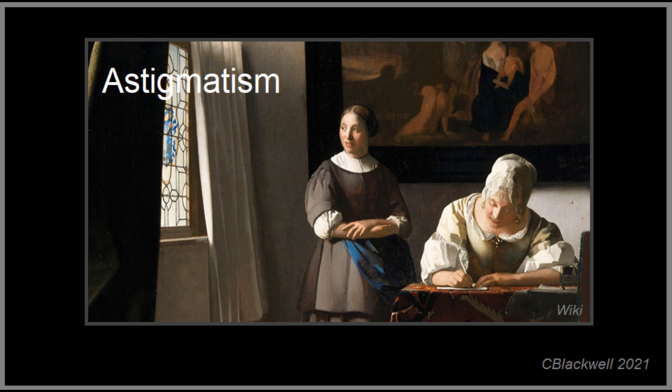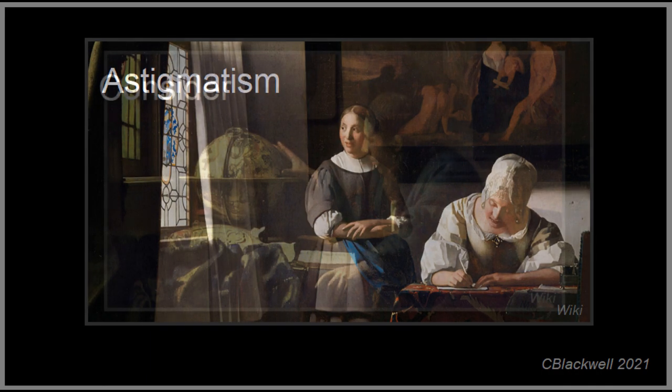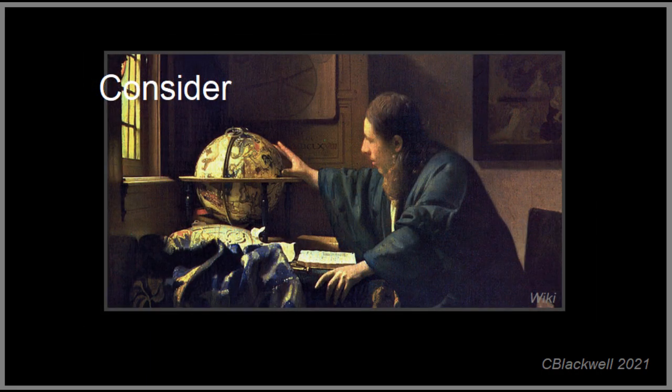One more point. No matter what kind of lens implant you have, if you have a significant amount of astigmatism, then vision will be blurry without glasses. There are different ways to correct for astigmatism, including toric implants, as mentioned earlier. In the end, deciding if it's time for surgery and then choosing a lens requires a thoughtful discussion with your ophthalmologist.